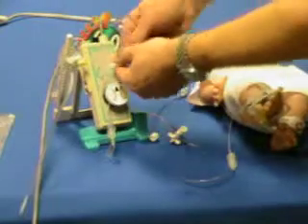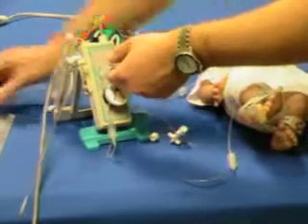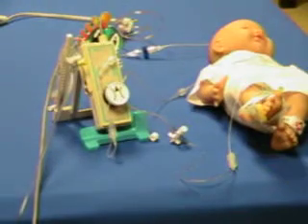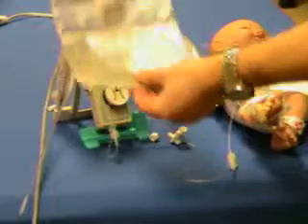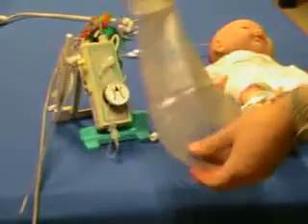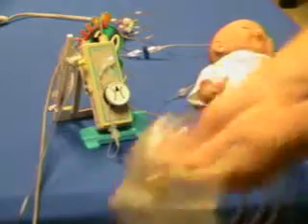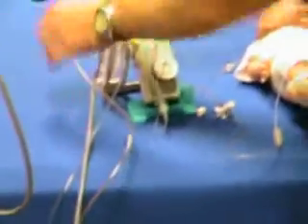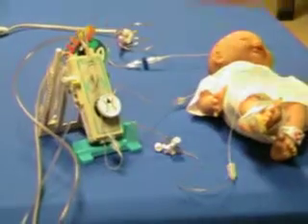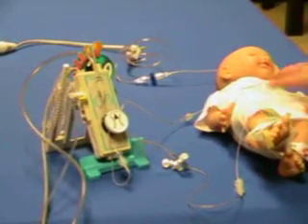Now we've got one more connection, and that's the collection bag. This is where it's going to collect all that fluid that we don't want going to the patient when it's going through its recalibration and priming while it's connected to the patient. So it looks like this. And what we usually do is just hang that on the IV stand. Make our final connection. And it should be ready to go.